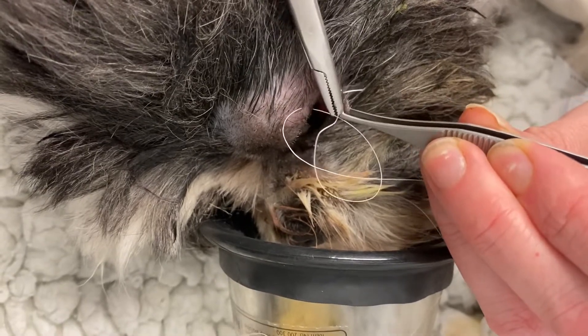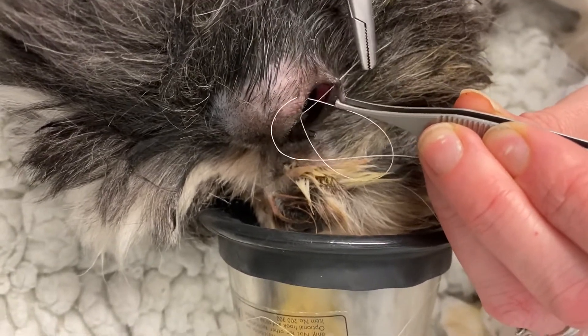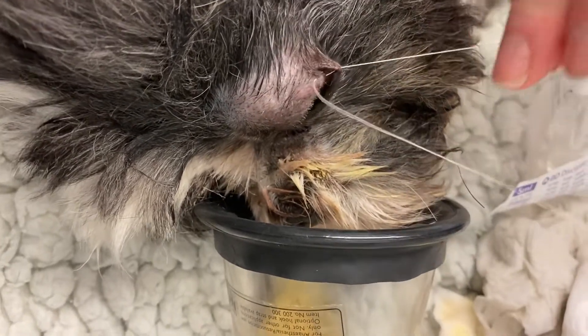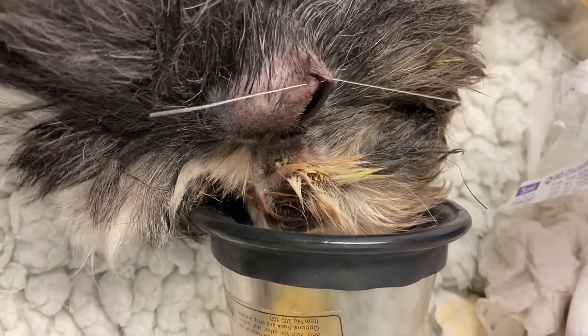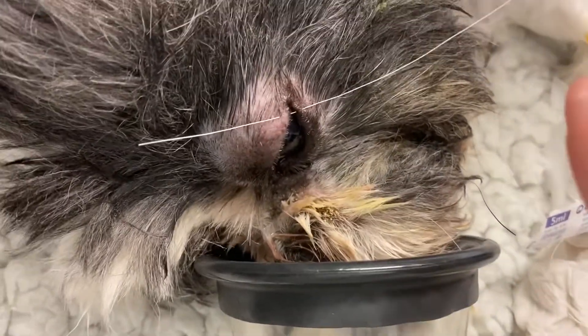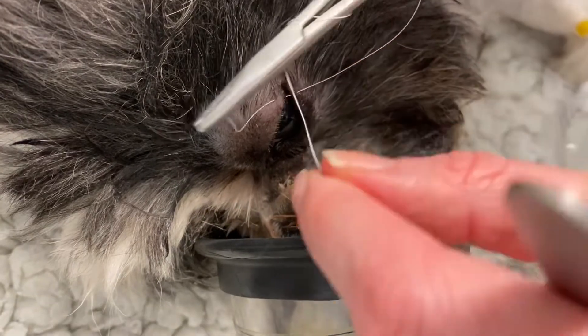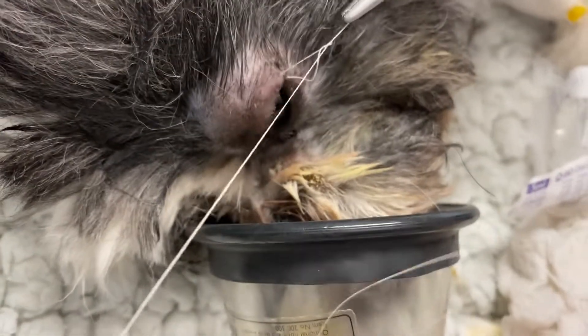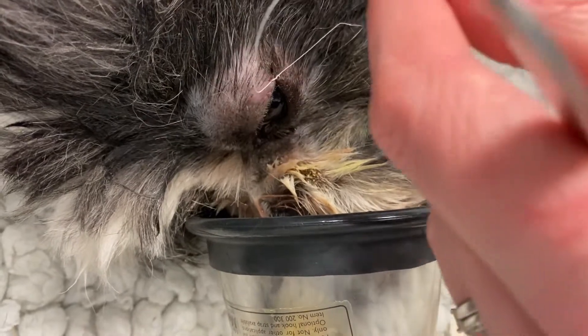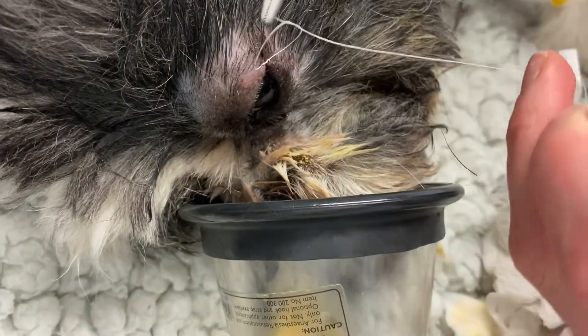Do be very careful in considering this, particularly if you're considering a diamond burr procedure in any brachycephalic patient. Those ones are much more prone to getting deeper ulcers developing and complications, so those owners need to be counselled very carefully about that before considering these procedures.